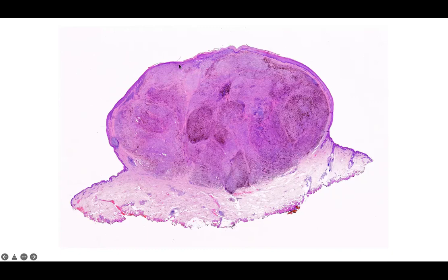In most of the nodular melanomas, I like to see absolutely no junctional melanoma here in the top part. So you have an effacement of the rete ridges, so it's hard to say that you don't have any involvement of rete ridges from low power. So you go to high power, you see that the overlying epidermis mostly looks like thinned out atrophic epidermis, but no melanoma in the junction there or in the actual intraepidermal compartment. Okay. So that's nodular melanoma.